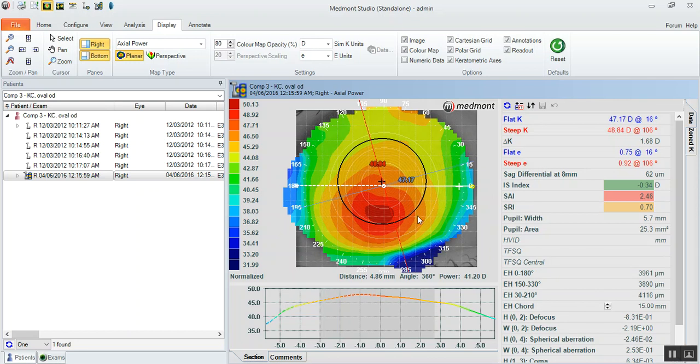So let me try to make more sense of this. An Ampleye 16.5 lens lands at 15 millimeters diameter. Its sagittal depth is measured from that chord of contact, that chord of bearing, that point of greatest and heaviest landing on the eye surface.